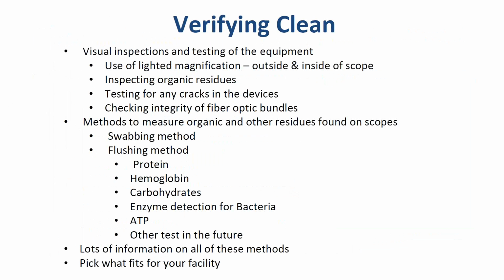So the recommendations that are in ST 91 include an enhanced visual inspection and testing of equipment associated with it. It does have recommendations for using lighted magnification, looking at the scope using magnification for any organic residue or any signs of wear and tear such as cracks or integrity issues with the device. And if those are noted, the scope needs to be pulled out of service so that it's not reused on patients.